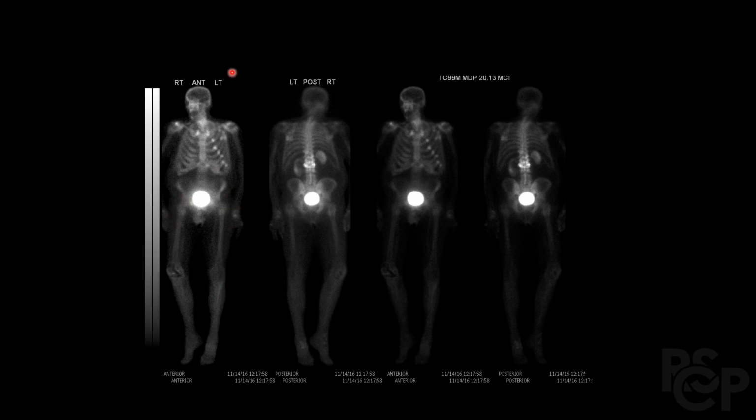So this is actually indicative of trauma, mainly because of the pattern of the ribs. You can see how these are the places where the ribs were broken, and they form a diagonal line throughout. The spine uptake likely is due to degenerative changes, which can also be picked up by bone scans. So again, this is very different from a metastatic or metabolic pattern. Metastatic would have increased areas of uptake dispersed throughout, while metabolic would be more symmetrical patterns, with the sternal tie and skull signs that we discussed in the last slide.